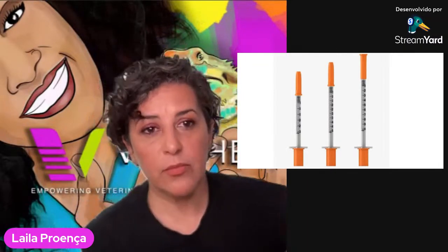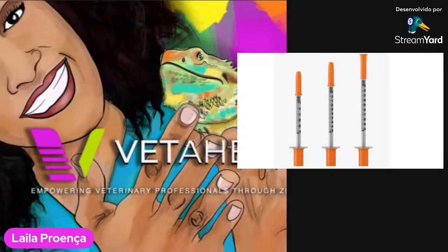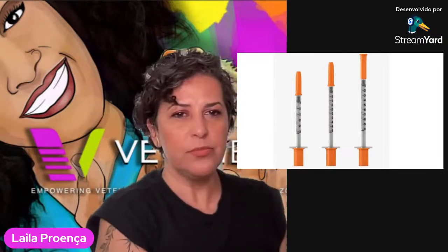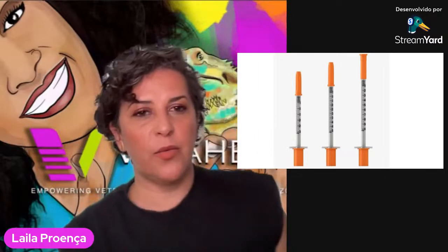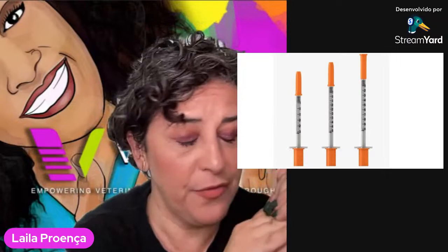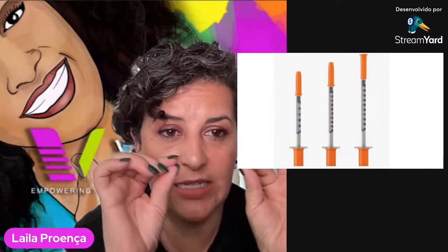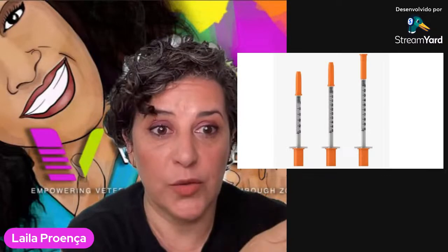It's not very indicated. Now, we have these syringes, and they really help. I find them very, very helpful, especially the syringes that are 0.3 mLs total in volume. They're very helpful because, first of all, they have less vacuum. They have less sucking power, so they don't collapse small veins. I find them very helpful. Also, they usually come with a 27-gauge needle or even smaller, so teeny, tiny needles, which for teeny, tiny animals, such as a hamster, for example, as we were asked, becomes very, very useful, right?